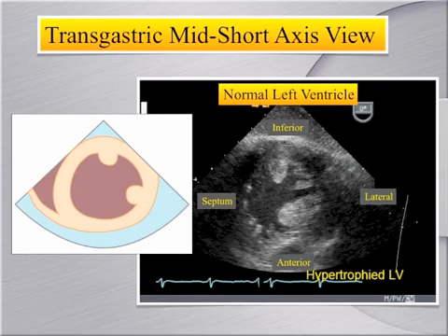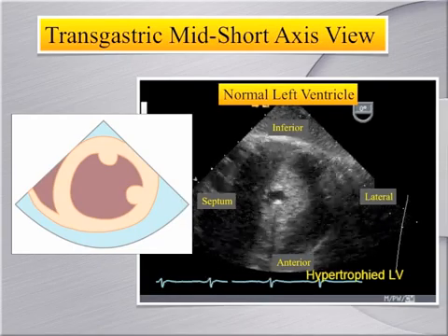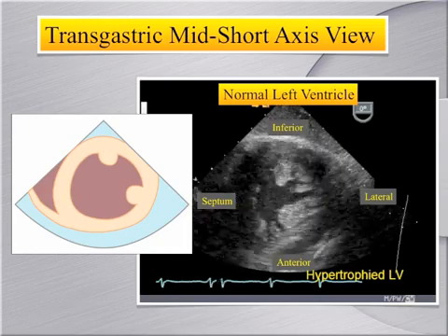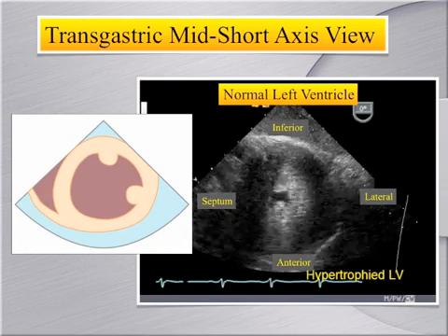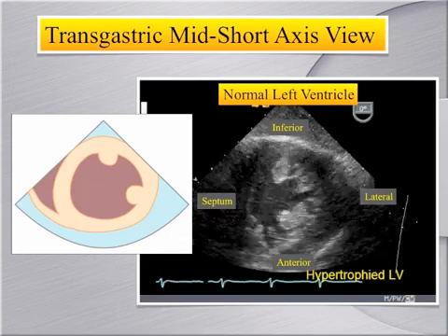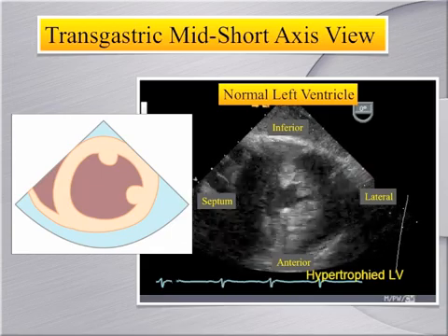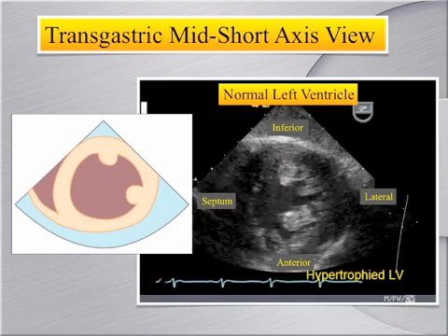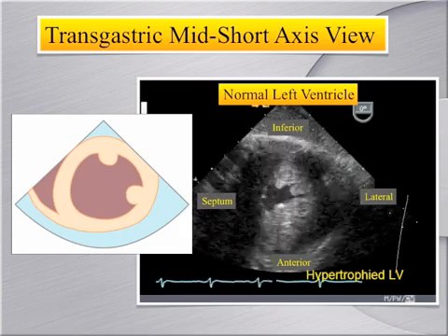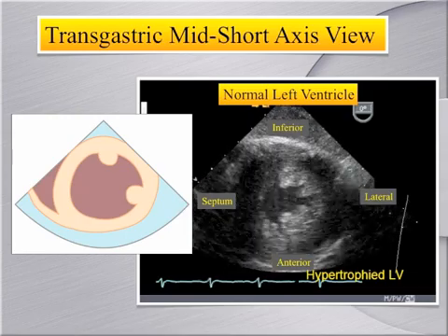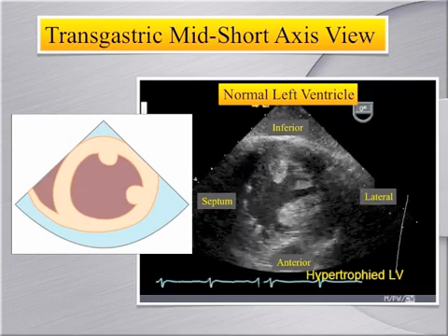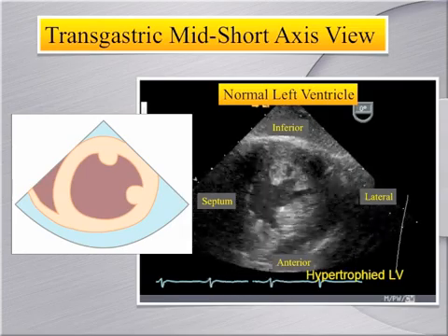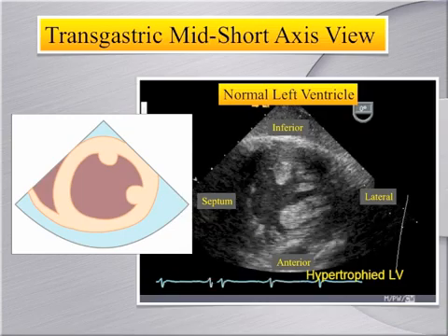Advancing the probe into the stomach and antiflexing gives rise to a series of transgastric views. The basal, mid, and apical levels are all used in assessing wall motion of all cardinal walls of the left ventricle. The mid-papillary view is essential for calculating shortening fraction, fractional area of change, and ejection fraction. LV systolic and diastolic volumes are measured here, and visual estimates of ejection fraction are also performed here.